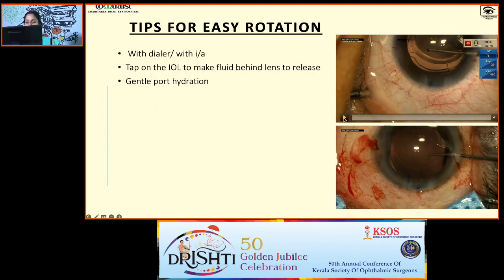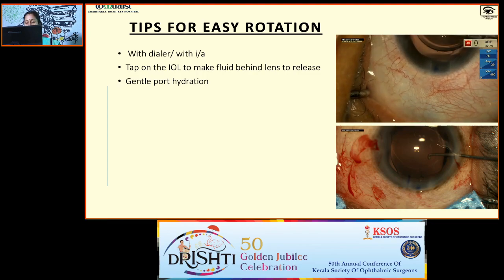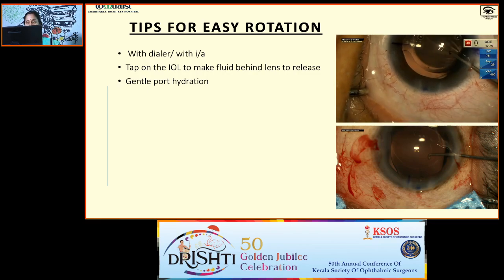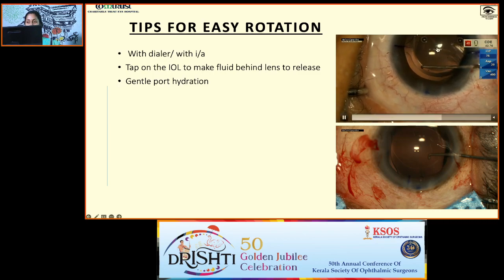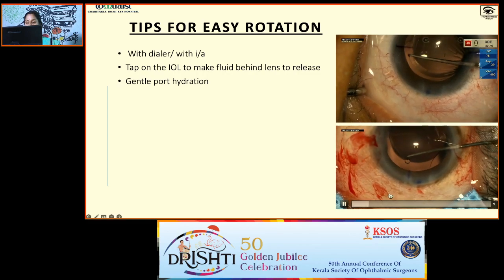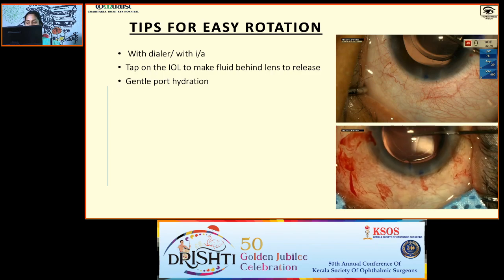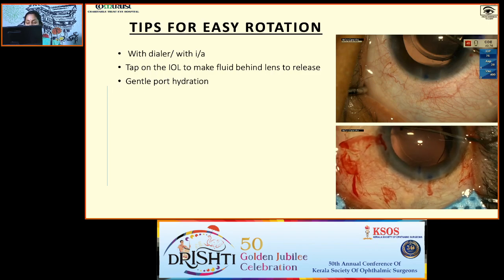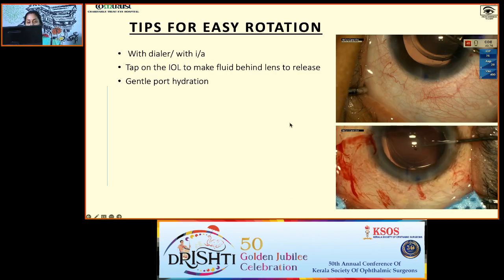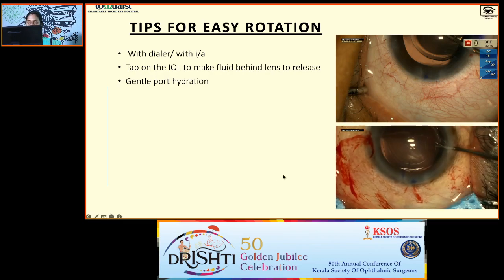For easy rotation of a C-loop IOL, you can just hook with your dialer at the optic haptic junction, pull slightly towards the center and rotate it to the desired axis. For a plate haptic IOL, it's better to rotate it partly when it is in the AC and partly in the bag, and once it reaches the desired axis, you can just press it and keep it inside. There's a dialing hole provided for the rotation. Once you complete this, you do a gentle port hydration without causing any further rotation to the lens.